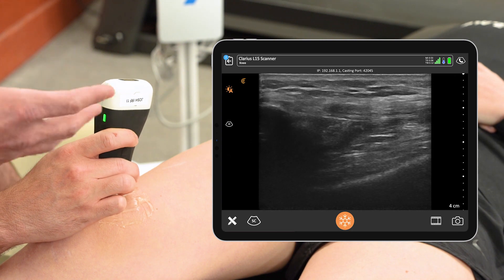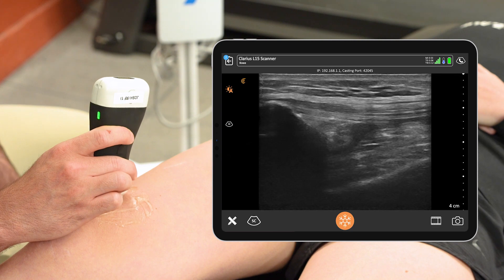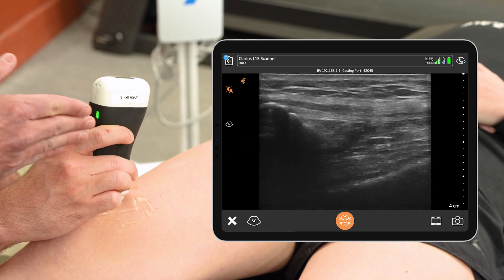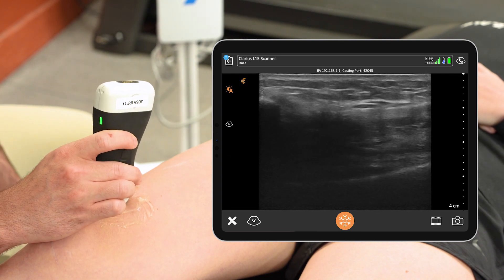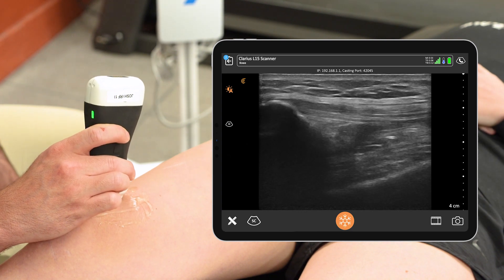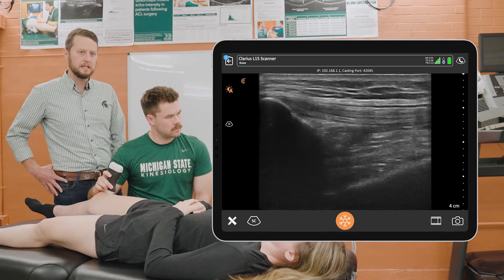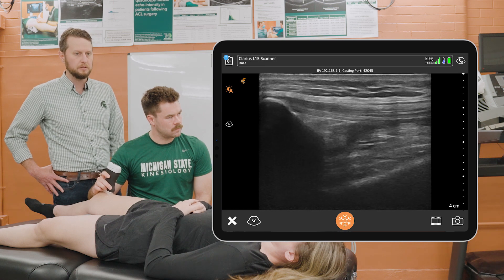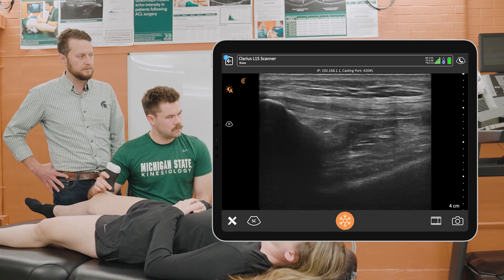After you position the probe in line with the knee at the superior pole of the patella, Cory is then going to move the probe medially and laterally across the quadriceps tendon and patella to find the location where this effusion synovitis is largest within this area. We can then use these images to grade this effusion synovitis on a semi-quantitative scale to quantify how large this effusion synovitis is.